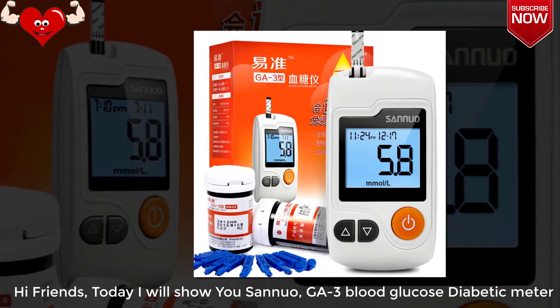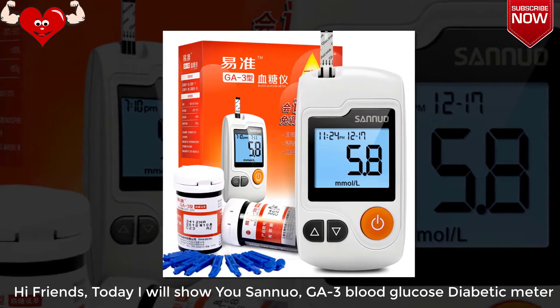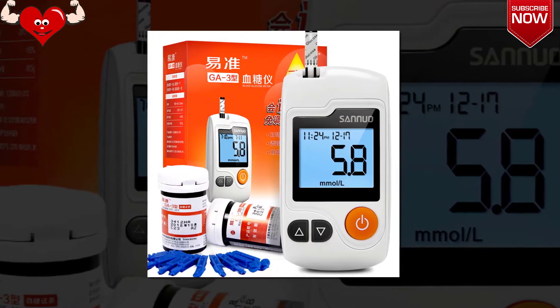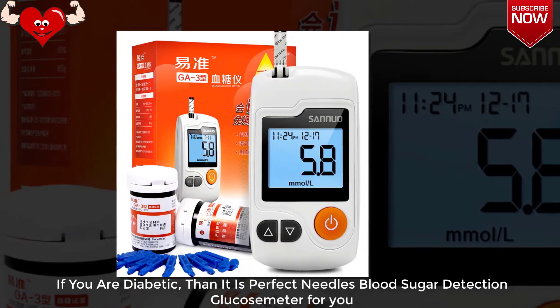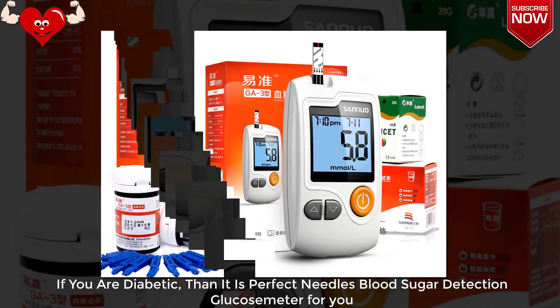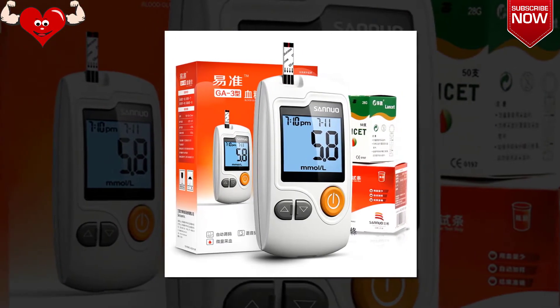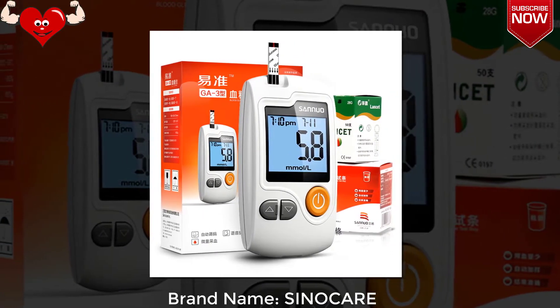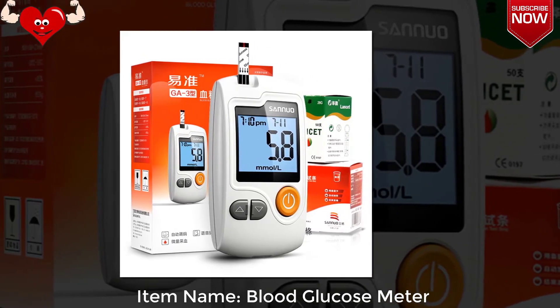Hi friends, today I will show you the Sannuo GA-3 blood glucose diabetic meter. If you are diabetic, then it is the perfect needleless blood sugar detection glucose meter for you. Product description: brand name Sannuo, item name blood glucose meter.